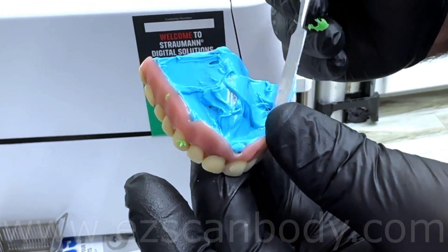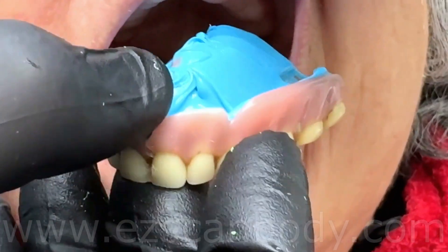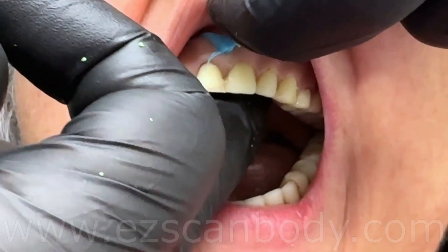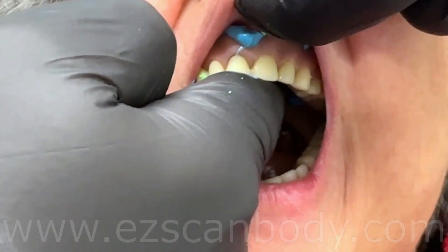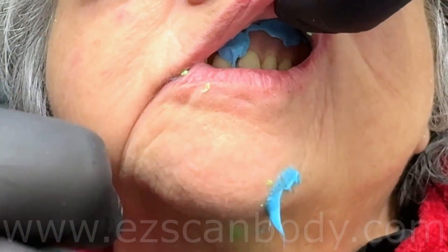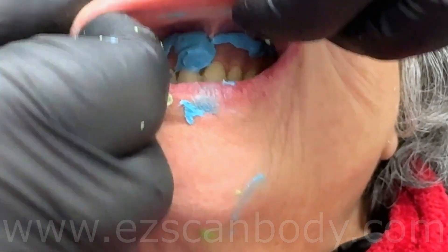If the denture is loose, regular body works better. Insert the denture carefully and push it from the back to flow the material forward, coming out from the front borders, not dropping into the patient's throat. Have the patient close gently in a centric relation. At this point, you need only to take the right vertical dimension, and if teeth are not occluded, it is fine.